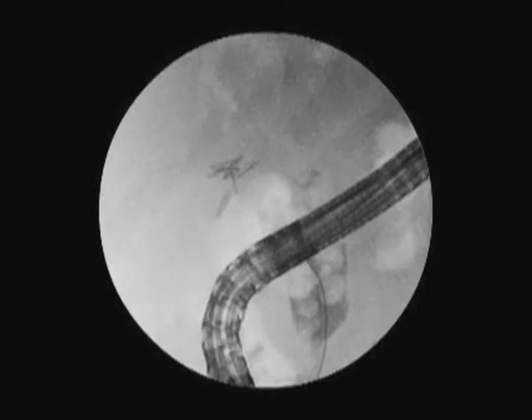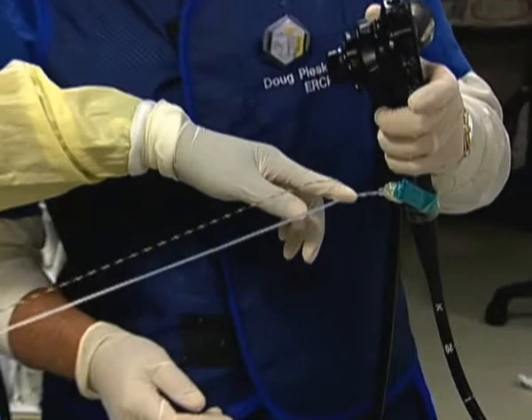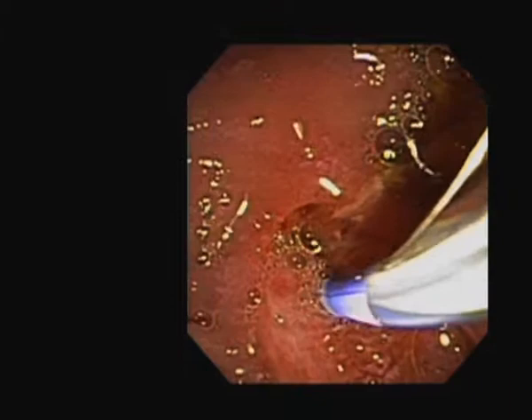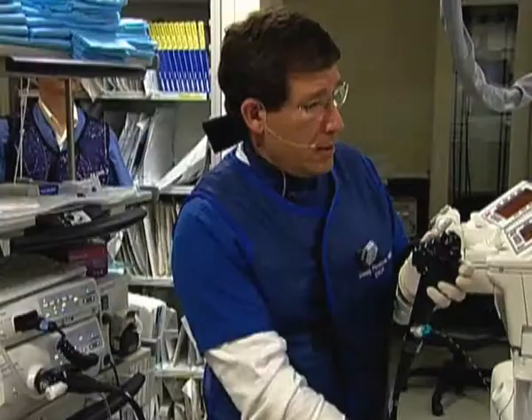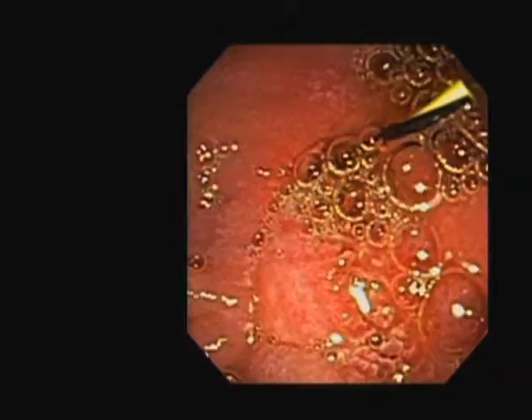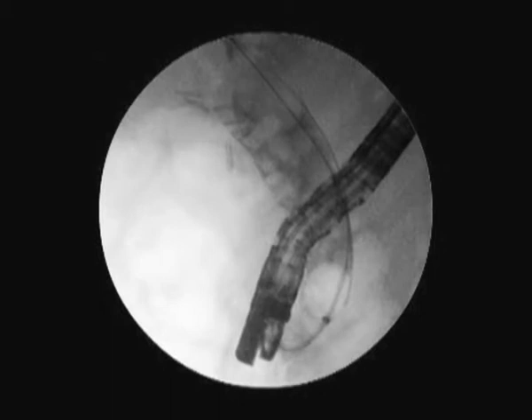We'll advance our wire — this duct is packed with stones. Jermaine is going to peel the wire down to the scope, and then we will remove our sphincterotome, leaving the wire in place as a ramp. Having this short wire in place is not a detraction from advancing the spy scope over the wire — we can use this very effectively. I prefer the shorter wire systems.